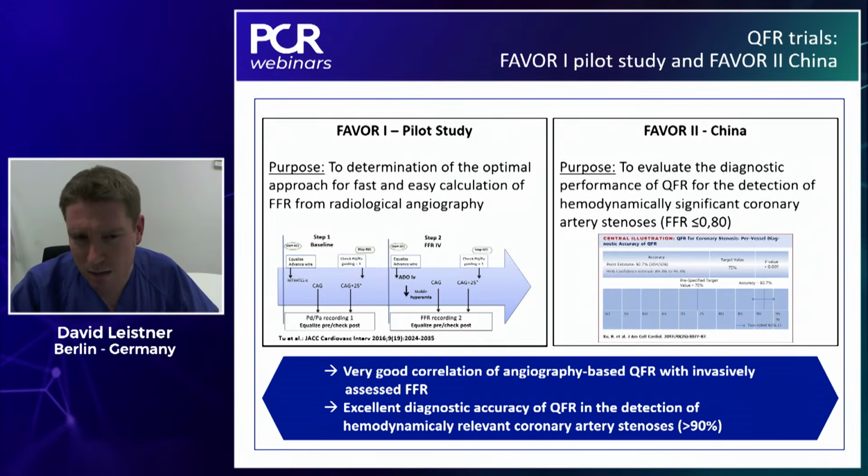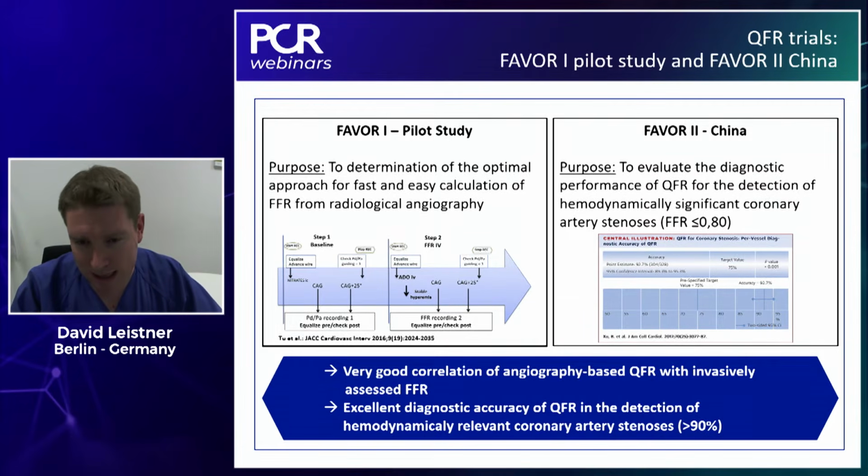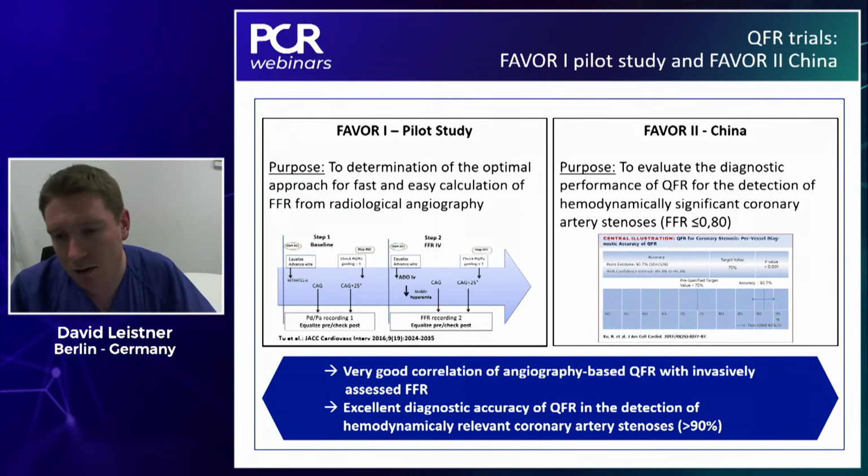And both studies were very important because they could show that there's a very good correlation between this angiography-based QFR with the invasively assessed FFR. And second, and I think this is most important, there's an excellent diagnostic accuracy of the QFR for the detection of hemodynamically relevant coronary stenosis.